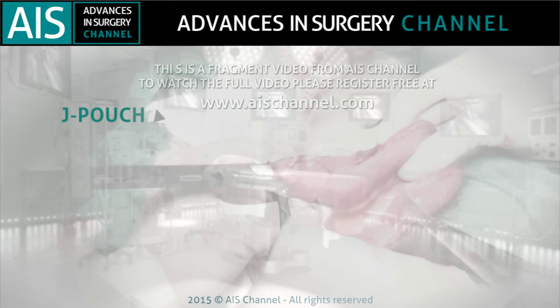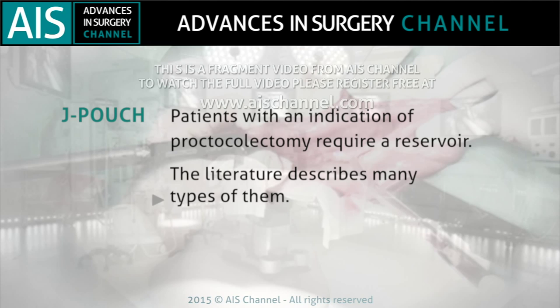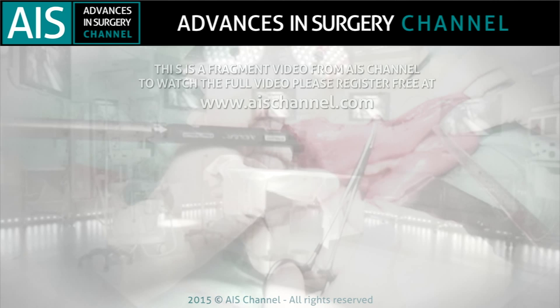Patients with indication of proctocolectomy require a reservoir to restore bowel transit. The literature describes many types of them. The J-pouch is the most popular one due to a favorable balance between postoperative complications and quality of life. This video is centered on the recommendations to build a J-pouch of small bowel.